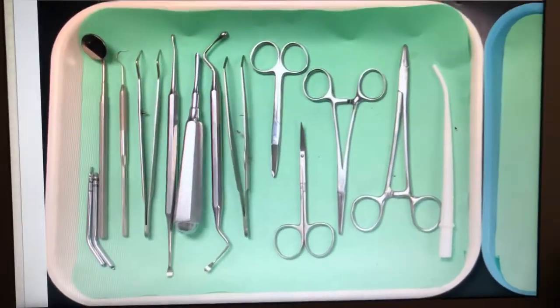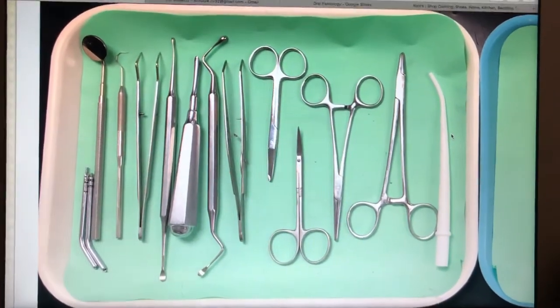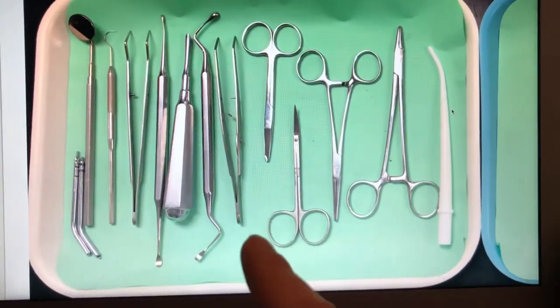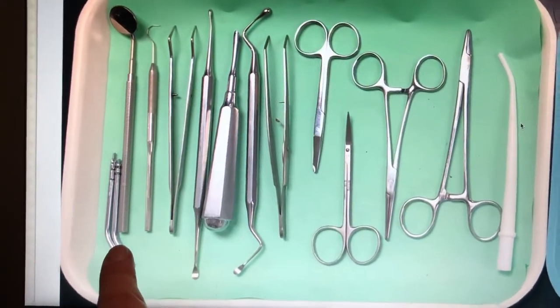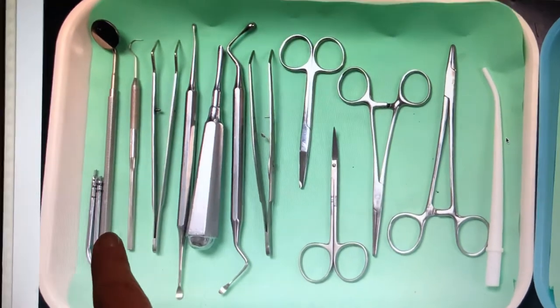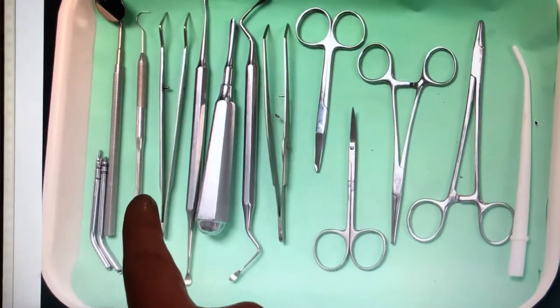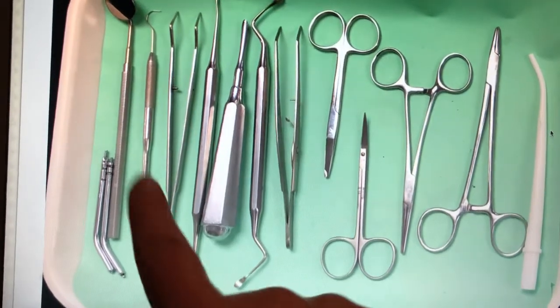This is going to be for the simple extraction tray setup. I ran out of ink so I'm going to use my computer screen to show you. We have our air/water tips that we're going to use to rinse and dry, our mirror that's going to be used to examine the mouth, and our explorer that's going to be used to check for any decay or abnormalities.